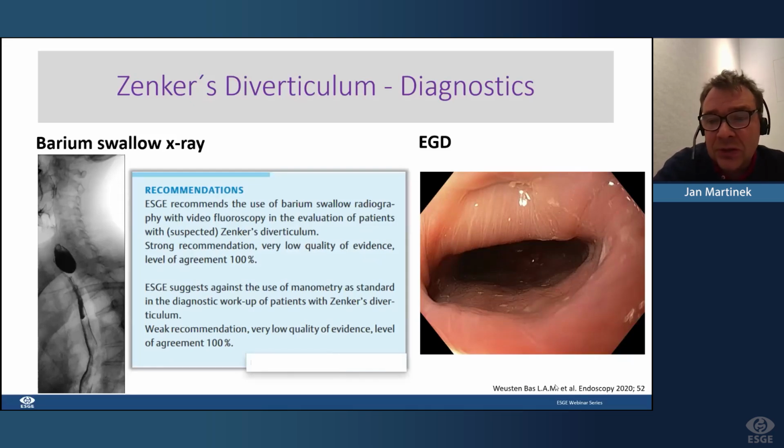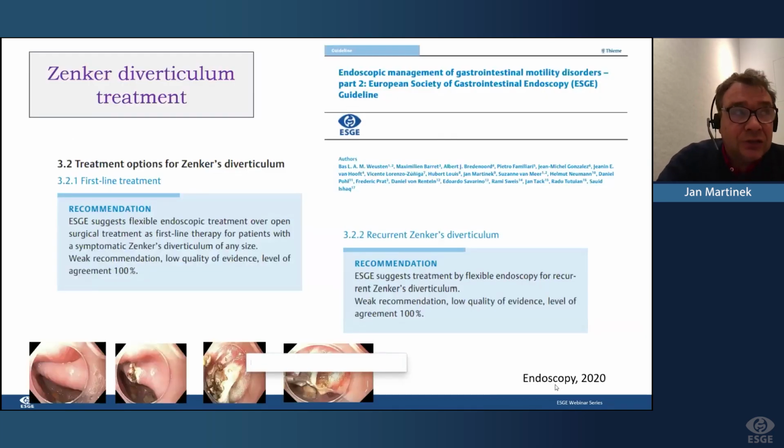And please note that each endoscopist, especially young endoscopists, should introduce the scope carefully in every patient, because every patient undergoing gastroscopy may potentially have a Zenker's Diverticulum. If the introduction is not careful, the scope might enter the diverticulum and cause a perforation. There is no need for standard manometry or FLIP examination in patients with Zenker's.